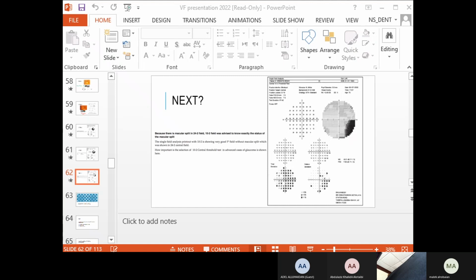And the mean deviation. What do we call it? It is continuous like this. Close? Yes. Why does it happen usually? Okay, but what else can cause this in the visual field? Hamid? Yes, the lens frame. Especially he's being corrected for +3 and with cylinder also. So the rim of the lens can cause this ring scotoma.